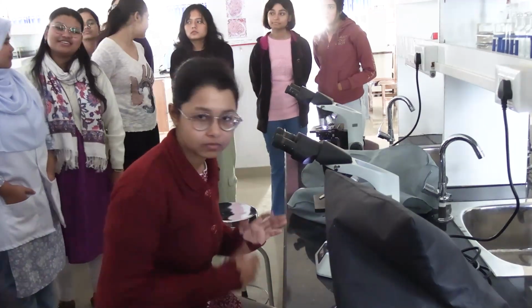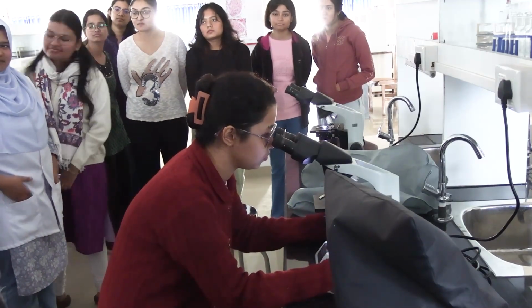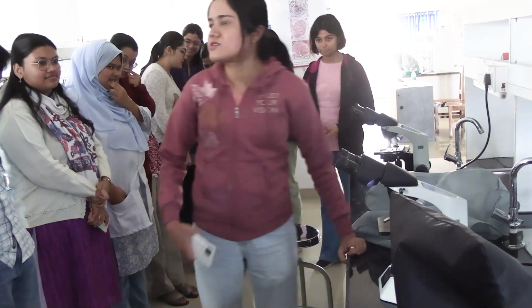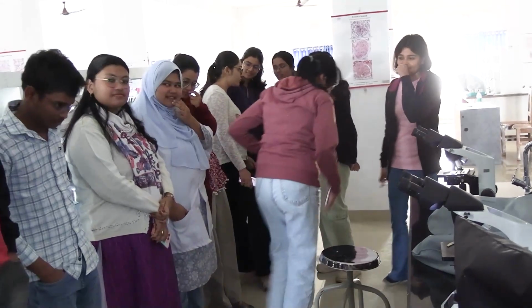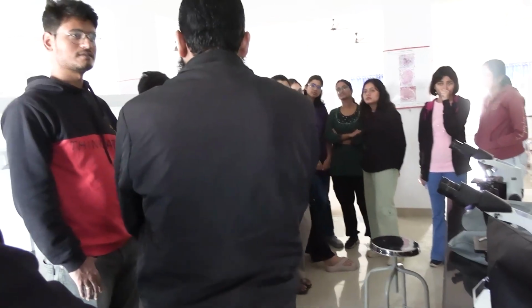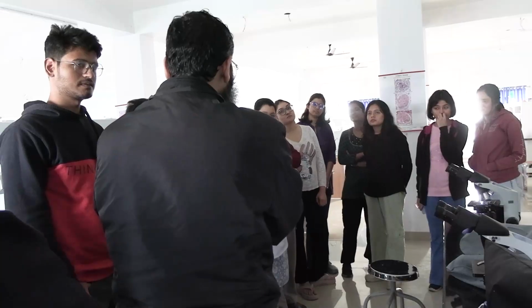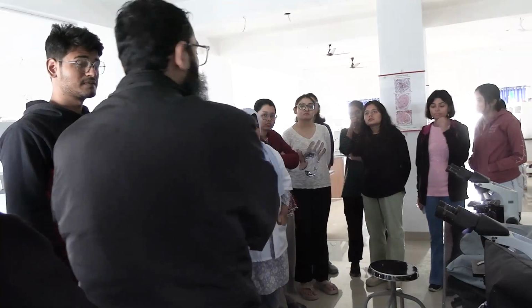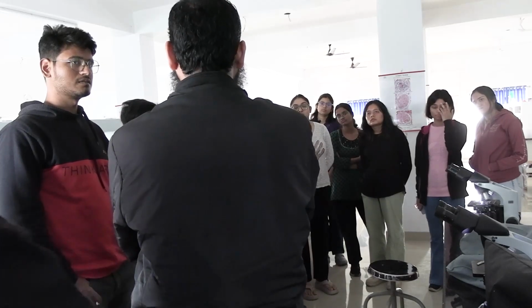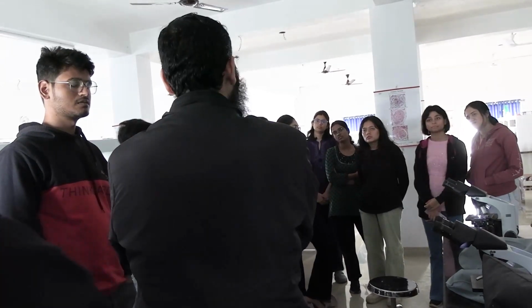তোমার কি আছে ইমপ্রেশন? নর্মোসাইটিক কিন্তু ক্রমিক মানে যেটা বুঝতে পারছি। আচ্ছা, ওটা বুঝতে পারছো না। নর্মোসাইটিক, ওকে। তো ঠিক আছে, কিছু জন আছে যাদেরকে মাইক্রোসাইটিক লেগেছে, মানে সাইজটা ছোট, বাট ক্রোমাশিয়াটা সবারই নর্মোক্রমিক ছিল। তো অ্যাকচুয়ালি এর এমসিভি ছিল 104, ঠিক আছে। আর এমসিএইচ ওয়াজ 34। তো এবার বলো কি হওয়া উচিত?